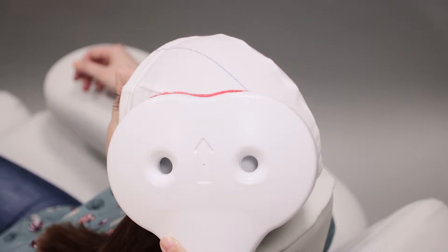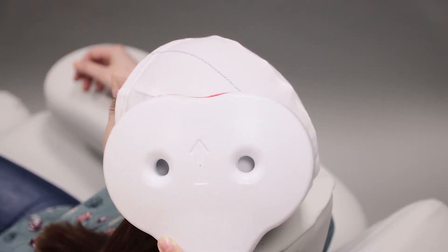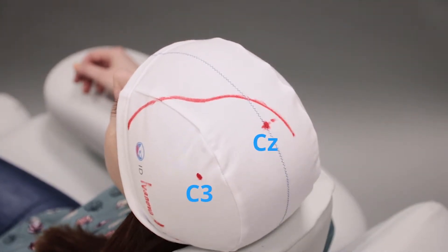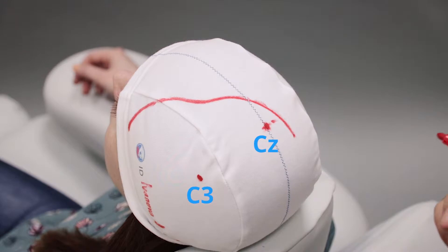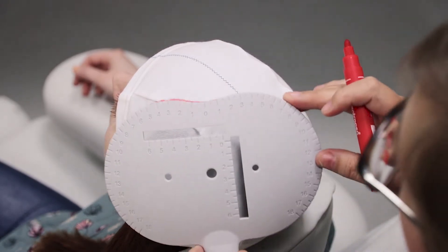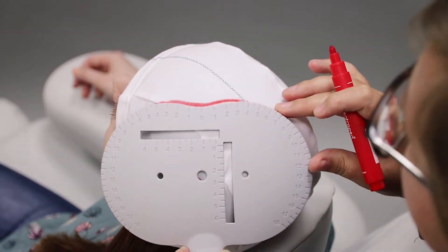After that, I loosen the screw on the flexible arm and take the coil away. I take the coil positioning tool and align it with the drawn line.